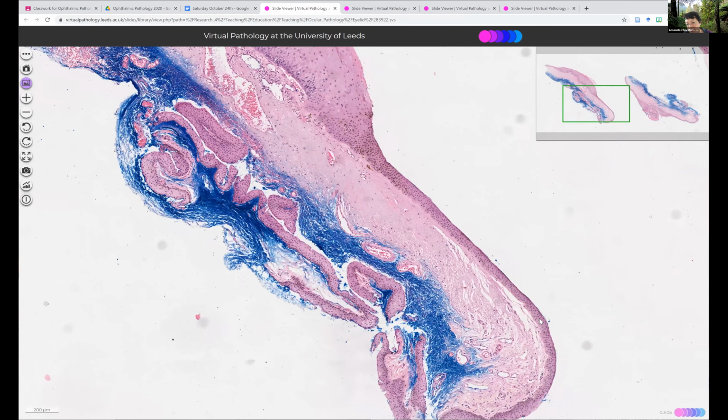Here are some more dysplastic features, like these multinuclear cells here. Yeah. So if we look at the little papillary bit just off to one side there, I think that was the worst part. This part here, the papillary. Yeah, and a lot of people were looking at the other one quite a lot.